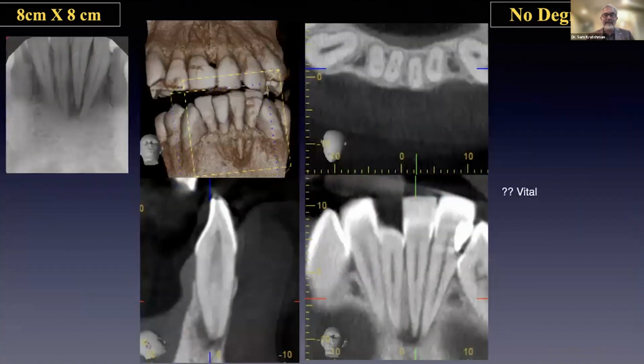And then with the same cone beam, I box the lower anterior region. And once again, these are very clear images. Look, this is important. Look at this lower anterior tooth. It looks like it starts off as one canal, becomes one large, broad canal in a buccal-lingual dimension, and then becomes one at the end, right? So this is like your GPS. This is your mapping of what you're going to expect before diving in and doing root canal.